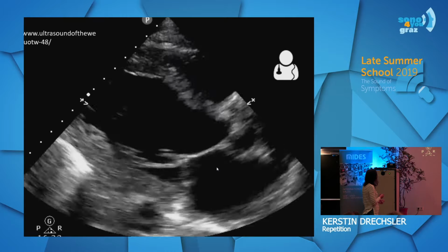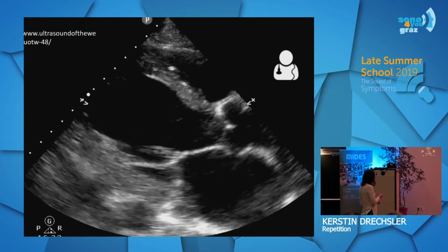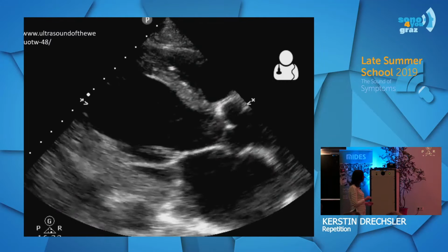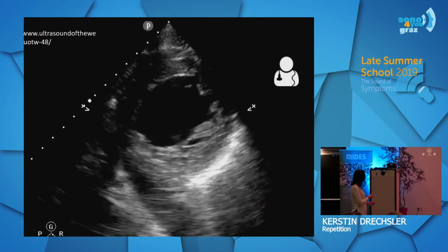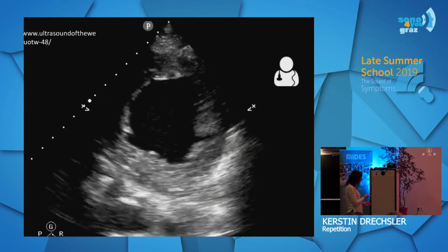So in the first video, we are seeing the left ventricle, right there. We are seeing the right ventricle. We are seeing the left atrium and the aortic bulb. Once again. We will now move on to the parasternal short axis, where we see the left concentric shaped ventricle and a little small part of the right ventricle.